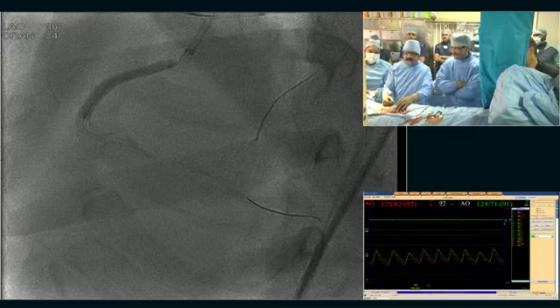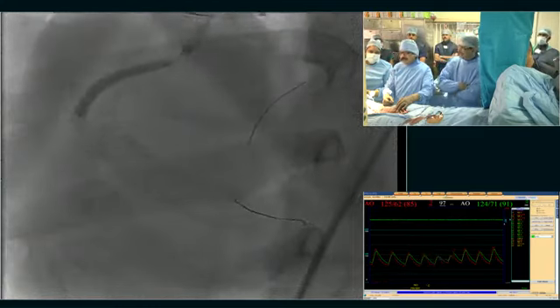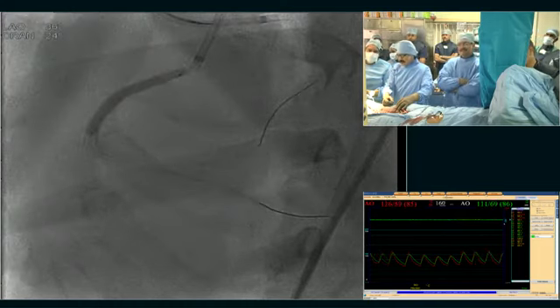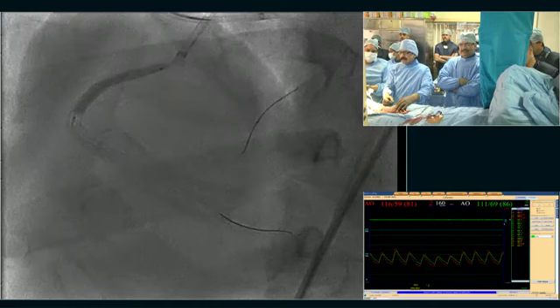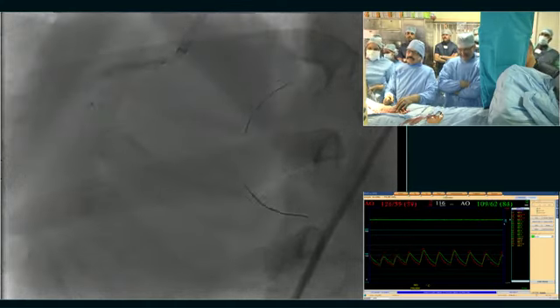So Dr. Rao, how much contrast volume? It would be interesting to know. 280 ml of Visipaque we use. Contrast volume is around 280 ml of Visipaque. Very good. Are you happy with that? You feel it is more for this long case and a hybrid approach we had.